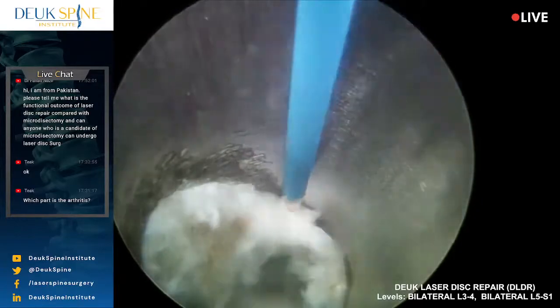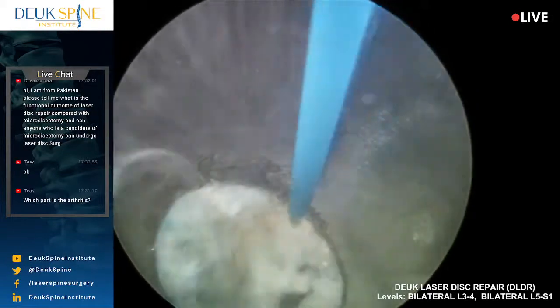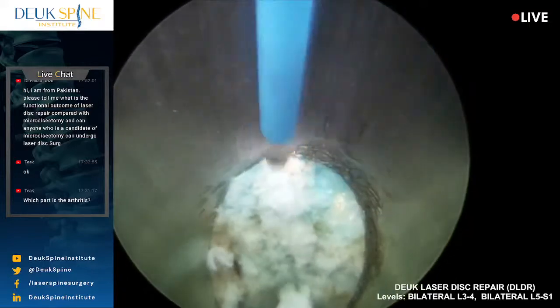This disc is just blown, man. It literally looks like a bomb went off in here. Everything is just shredded. I don't know what this guy did, but he must have fallen and injured his back or something. This is horrible.